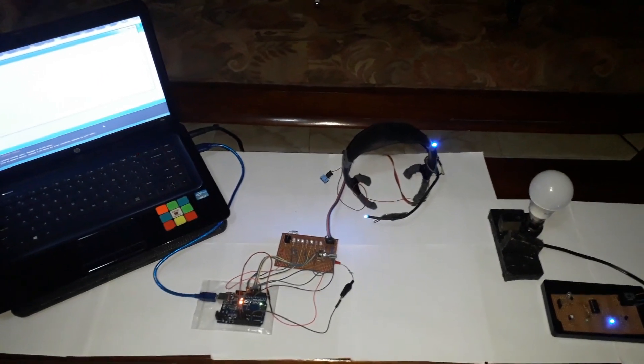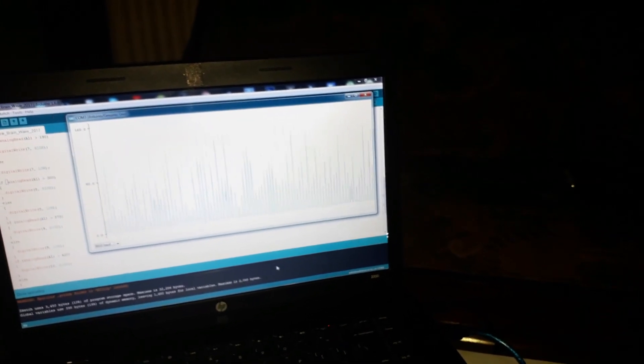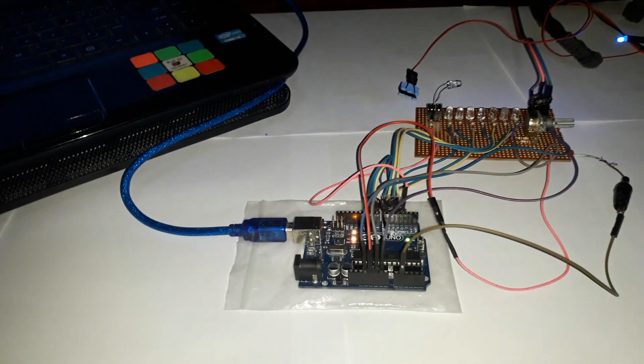Okay, let's see some close-up. First of all, this is my code and you can see the graph going in here. And when I'm going to touch this piece, you can see it's changing — it's changing, and this light is blinking.